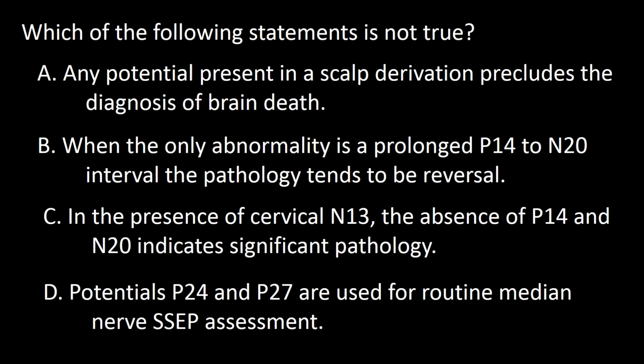Next question. Which of the following statements is not true? A. Any potential present in a scalp derivation precludes the diagnosis of brain death. B. When the only abnormality is a prolonged P14 to N20 interval, the pathology tends to be reversible. C. In the presence of cervical N13, the absence of P14 and N20 indicates significant pathology. D. Potentials P24 and P27 are used for routine median nerve somatosensory evoked potential assessment.